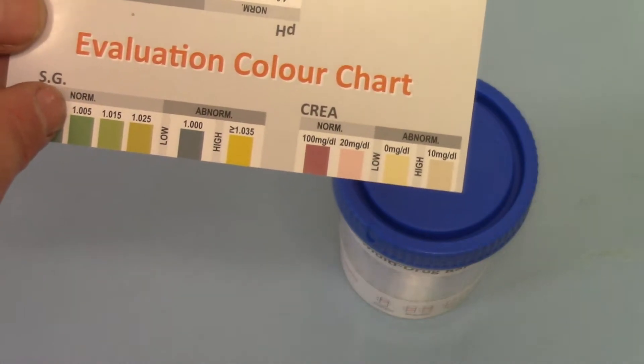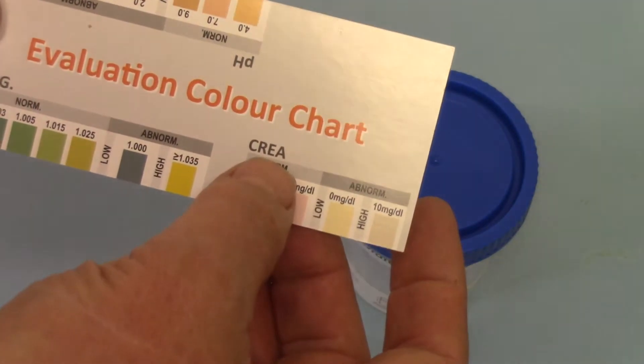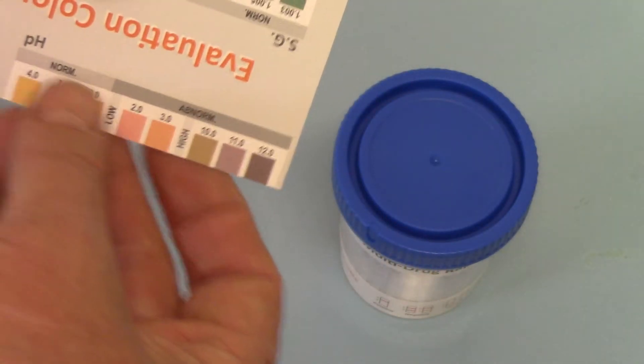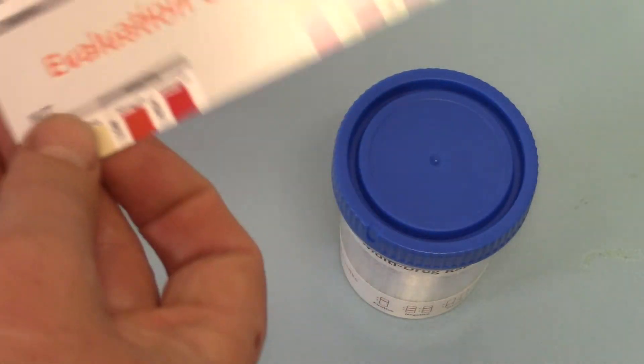You've got SG which is specific gravity, CRE which is creatinine, and pH showing here and on the reverse.